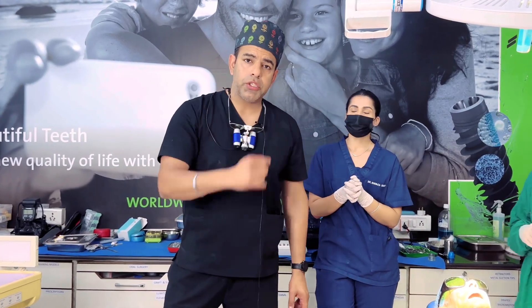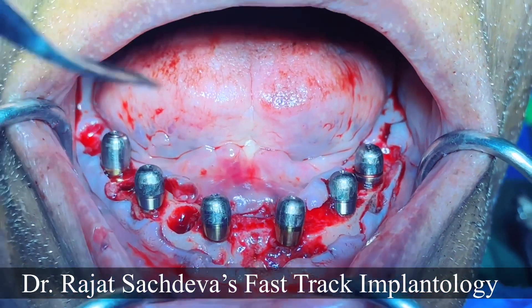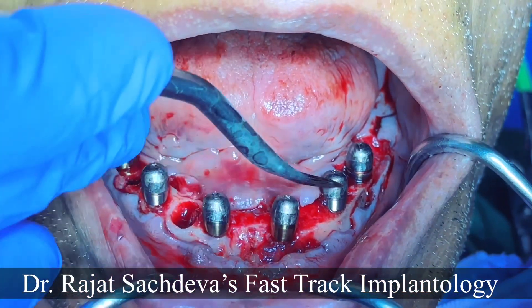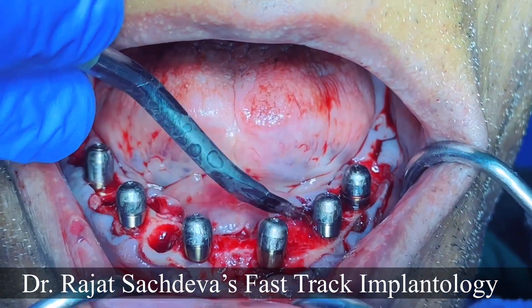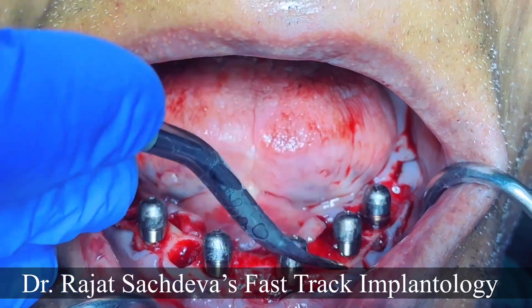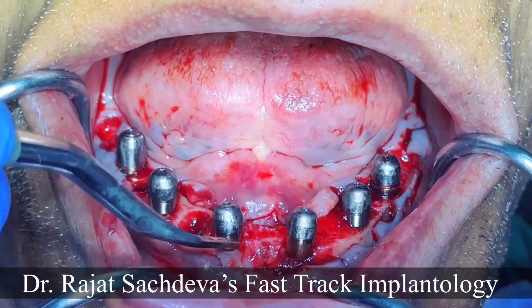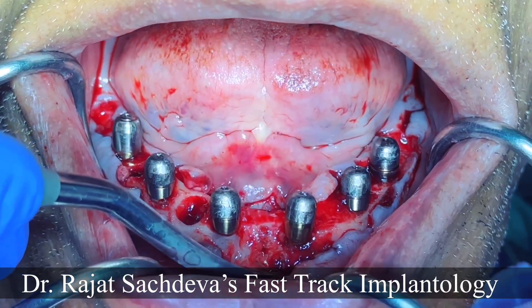I want to show this clinical case where we have done the implant placement. We placed 6 implants here, and you can see the extractions. This is the extracted site; here we have grafted it. After that, we raised the full thickness flap. We can now reflect and tie the lingual flap. The multi-units are at 30 degrees, 17 degrees, and straight. We got a good torque and good ISQ.